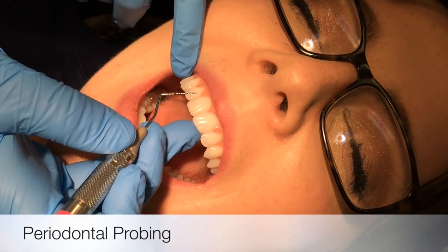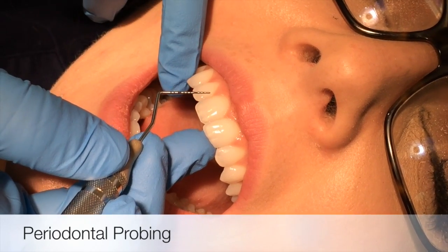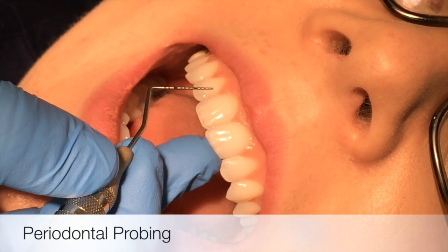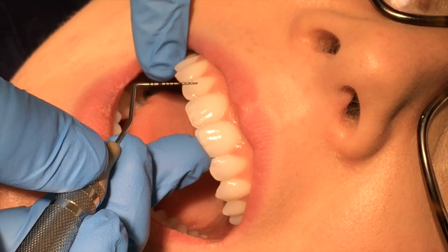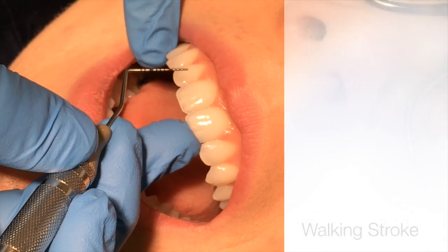We use the periodontal probe to evaluate the health of the periodontium. Common problems in evaluating the depth of pocket are inaccurate depths and patient sensitivity. These can be corrected with remembering three keys of probing: adaptation, walking stroke, and access.